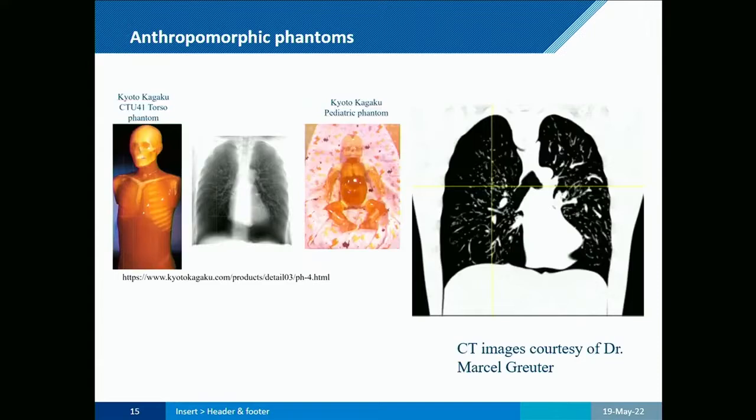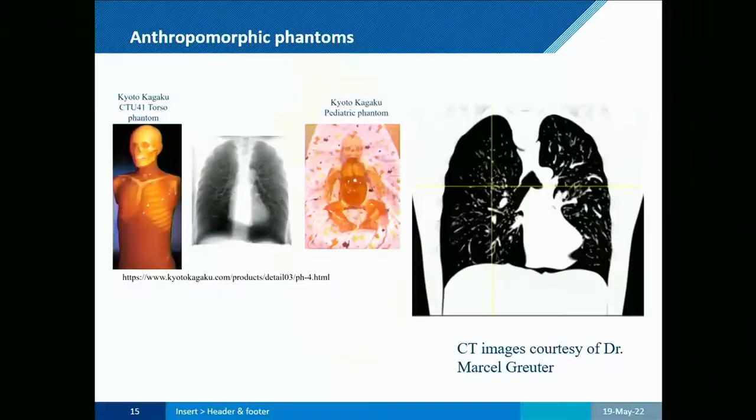Then in the market, we also have more realistic anthropomorphic phantoms, like this one you can see here. But one of the problems they have is that usually they are very expensive, they are not portable, and you are only tied to having one anatomy to test everything.